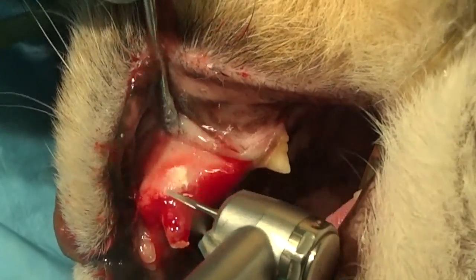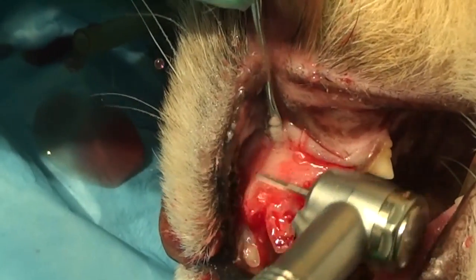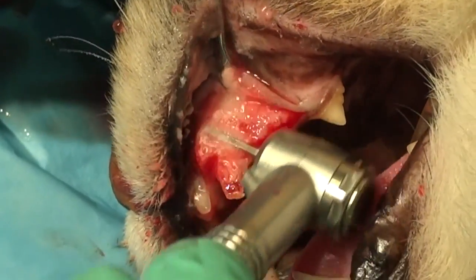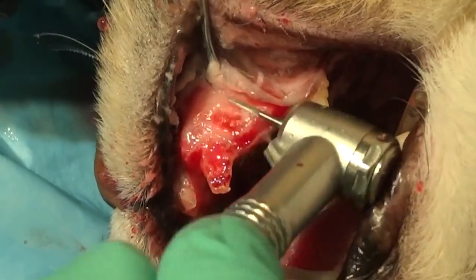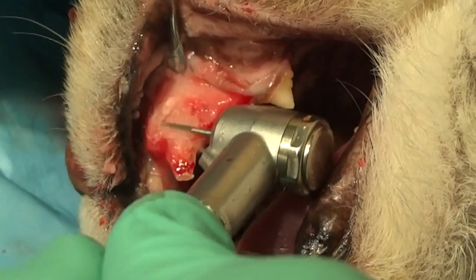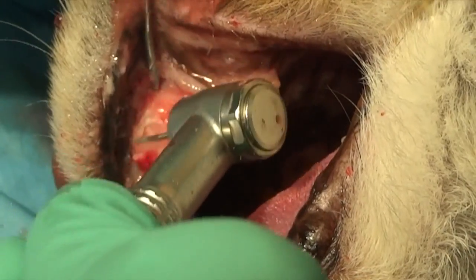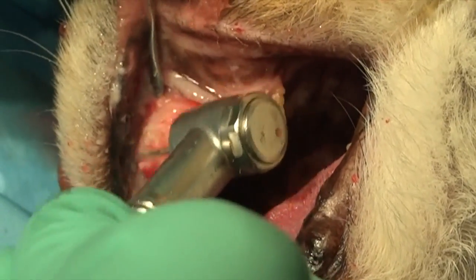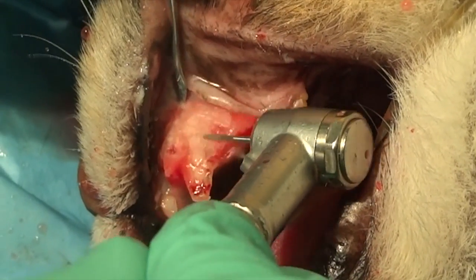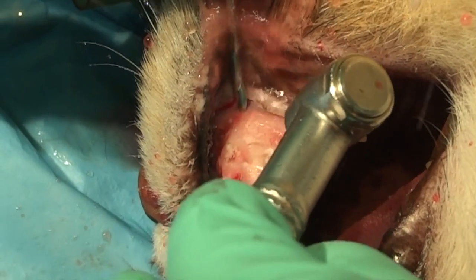Then we use the periosteal elevator to retract that tissue, and now we're using that cross-cut just to kind of paint away the bone to see where the interface is. We want to make sure that we can visualize where the bone has replaced the tooth root, and then, based on that visualization, make an incision with that cross-cut apical to the bone interface and the tooth, and leave nothing but bone there, and then come back and smooth that with a diamond football burr.